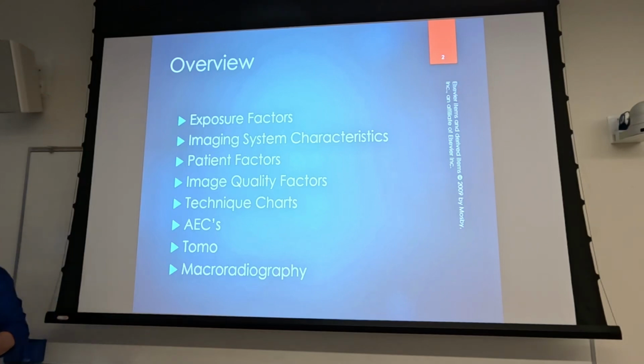Now, it's not going to be this way throughout the curriculum. When we go back through imaging in sophomore year, you're actually going to have to work the questions. You're actually going to have to work formulas. So what I mean by that is right now, and we've touched on this, inverse square law tells us radiation exposure changes with changes in distance. So if you increase your distance, your radiation exposure goes down. We've used the example of being in a fluoro room and stepping away from the table, just to lower your radiation dose, right?